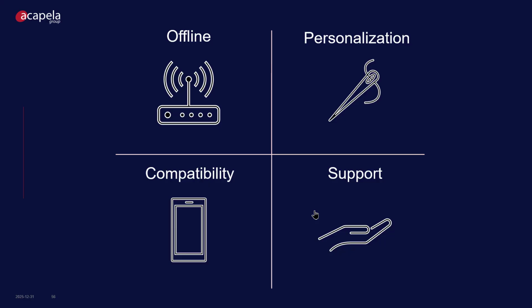Now, there are obviously great benefits of having the Acapela My Own Voice. One of the key benefits is that it's an offline solution, and there are great benefits from that. We want somebody to have their voice regardless of where they are. If they're out and about, we don't want them to suddenly have to switch synthesizers. But also there are lots of data security reassurances, that when you generate a phrase, that phrase is only communicating with your device and your speakers.